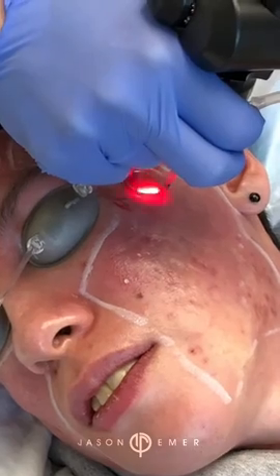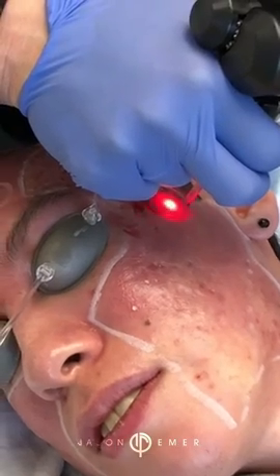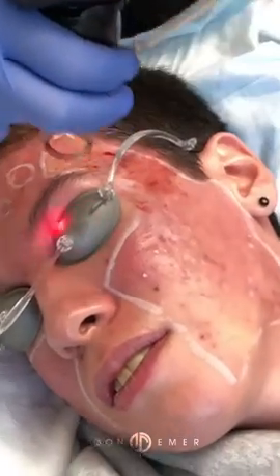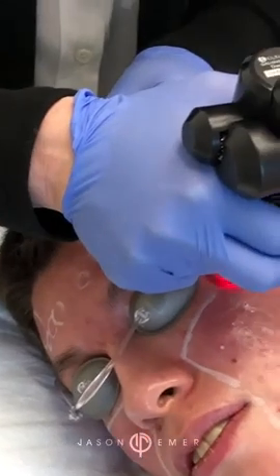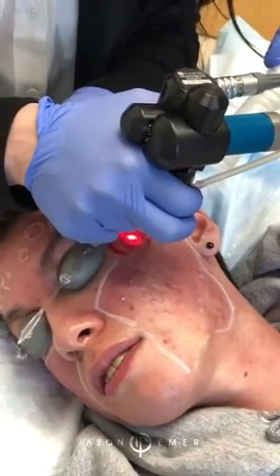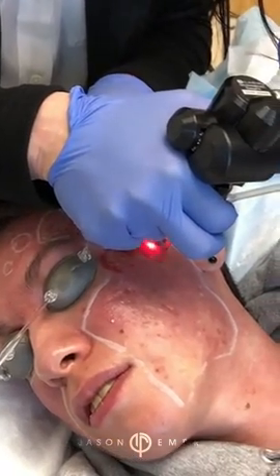Since then, we've done a series of microneedling treatments to try to improve the scars. He had a lot more, I would say, defined scars before this. Now they're not as defined. Now it's more of the rolling. So we just did a TCA for those that were tuned in a little bit earlier. TCA is a chemical that we use to treat ice pick scars. They form a bit of a scab, and that scab heals and it actually fills in the space inside of the acne scar.